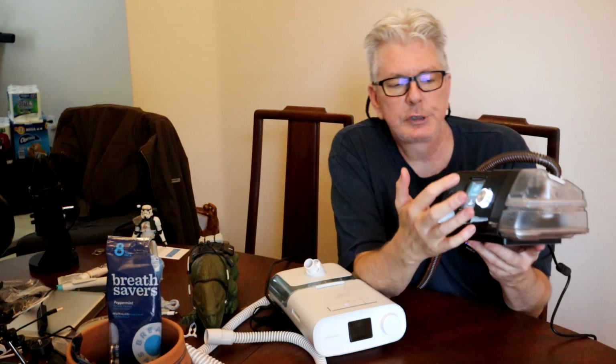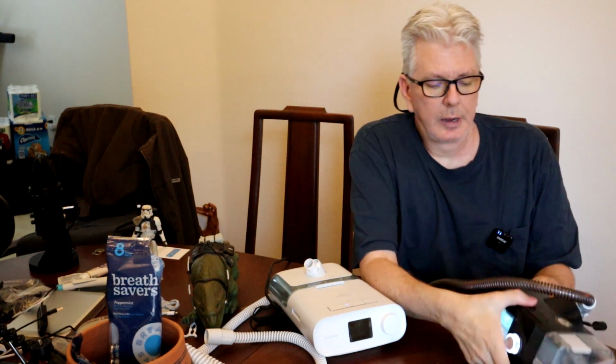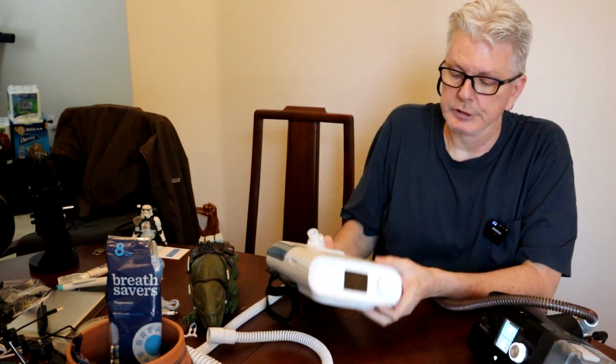You can Google a bunch of different videos, and they'll show you the different menus, how to get around in the menus. Both very similar. They have a button here, and you just select up and down, and they both work relatively the same way. You just roll the dial, and then to select something, you press and select it. And getting into the clinical settings is not hard, and there are videos on that that do a lot better than I can do. So check that out if you want to adjust your settings.